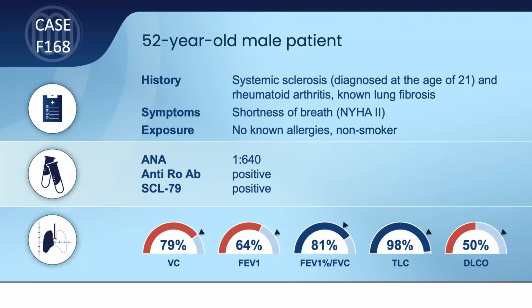One question came in: do you perform core biopsies or FNA? We do neither. In the context of connective tissue diseases and diffuse parenchymal lung diseases, neither core biopsy nor fine needle aspiration biopsies suffice. There are two options to biopsy these patients. One is the so-called cryobiopsy, which is done by bronchoscopy. You put a probe into the lung periphery, cool it down to -80 degrees, pull it out, and you get samples a few millimeters in size. Or you perform a surgical lung biopsy, usually done via video-assisted thoracic surgery.